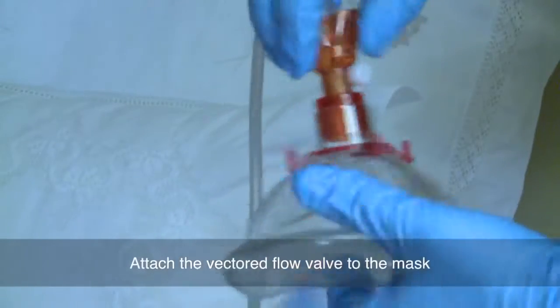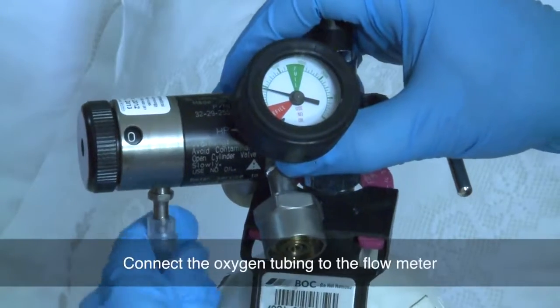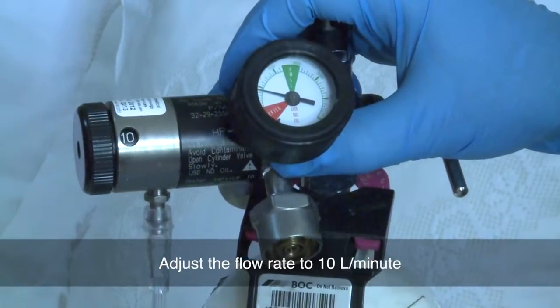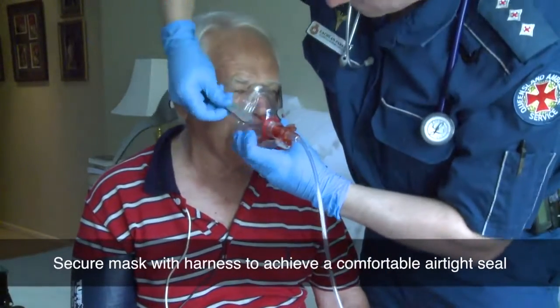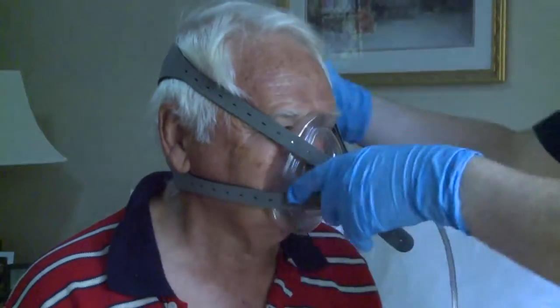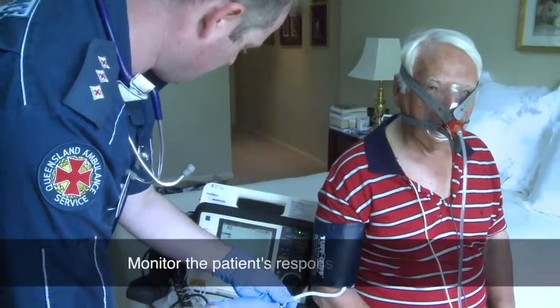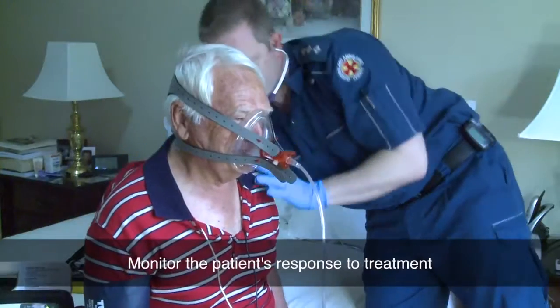Attach the vectored flow valve to the mask, connect the oxygen tubing to a standard 15 litre per minute flow meter, and adjust the oxygen flow rate to 10 litres per minute to generate 8 centimetres of water of continuous positive airway pressure. Position the mask on the face of the patient and secure using the supplied harness to achieve a comfortable airtight seal. If the patient is apprehensive, ask the patient to gently hold the mask on their face and secure when possible.